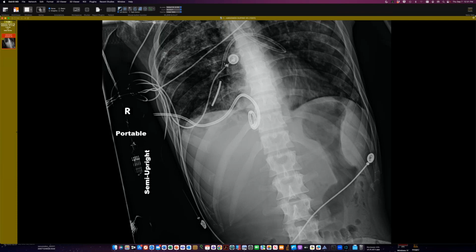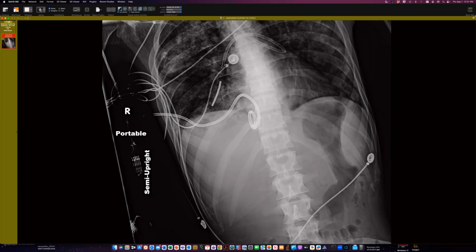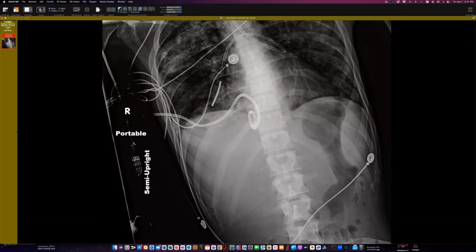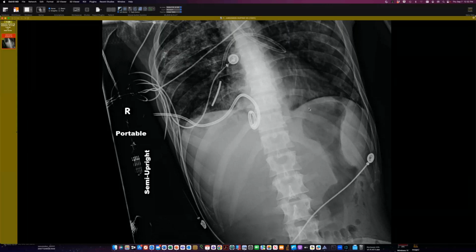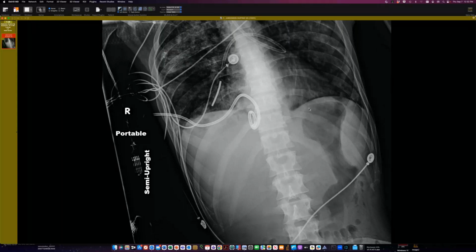And when they pushed, they actually forced it to buckle and to go down the other side of the carina into the left bronchus because this was jammed down here. It does not go down into the left bronchus, decide to turn around, and track back and then go down to the right. That would be a difficult hairpin turn like that. It went down to the right initially and then it folded into the left as they continued to hammer it in. So that's not what I would want for my catheter placement or my enteric tube placement.